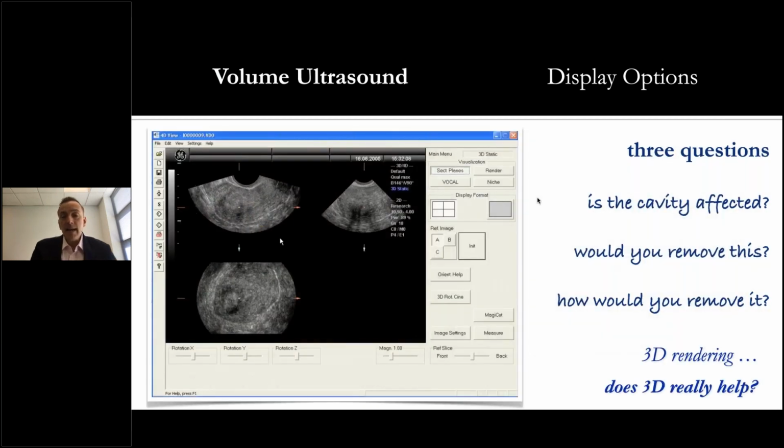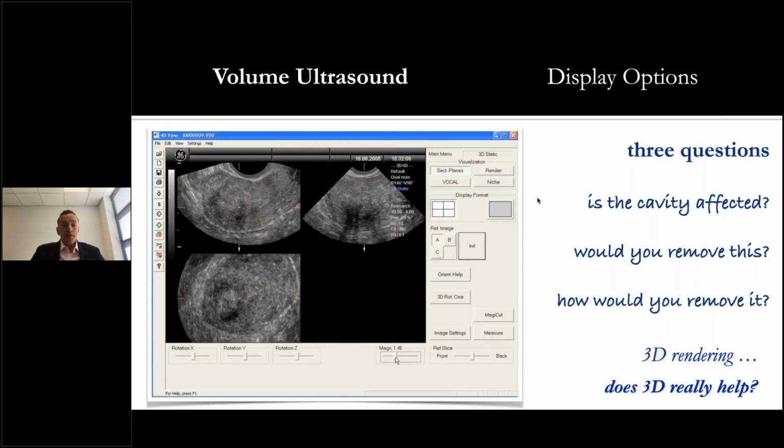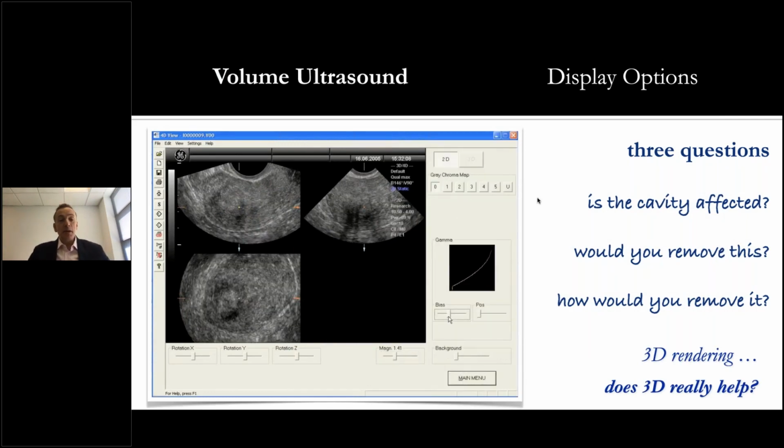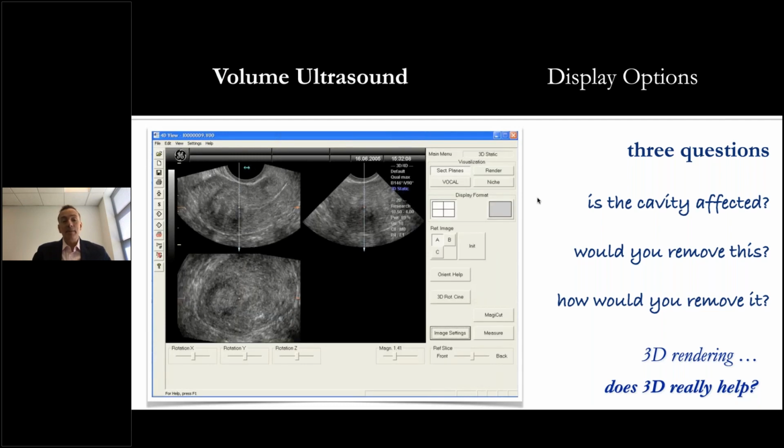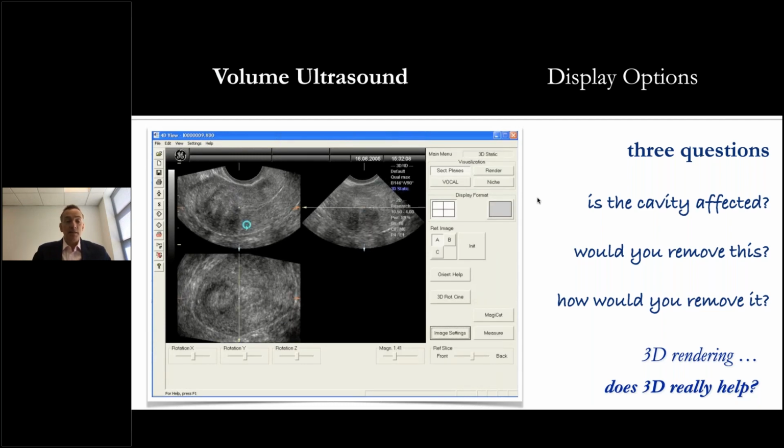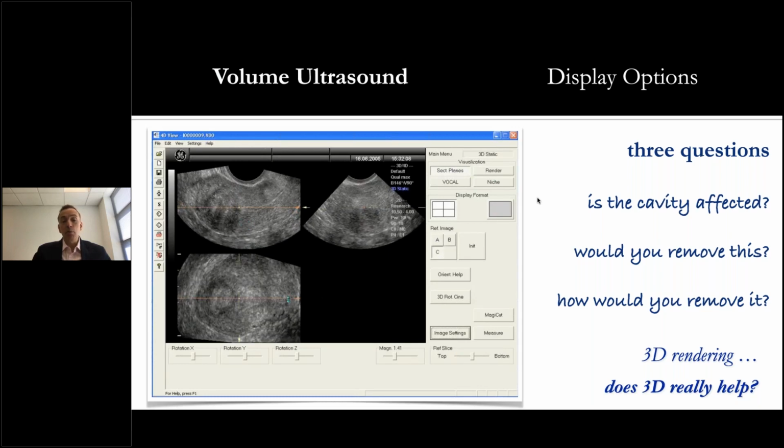This is again my World Cup fibroid. Okay, so you'll see why it's the World Cup in a minute. So look at this basic picture, really unclear. The images blur into one. There's probably some degree of adenomyosis here. So you cannot be clear in that picture whether there's a fibroid, if there's adenomyosis. It looks like there's a fibroid, but it's, you know, a poor quality image.